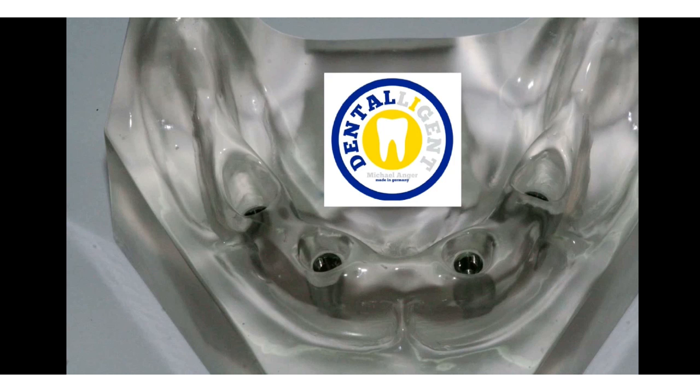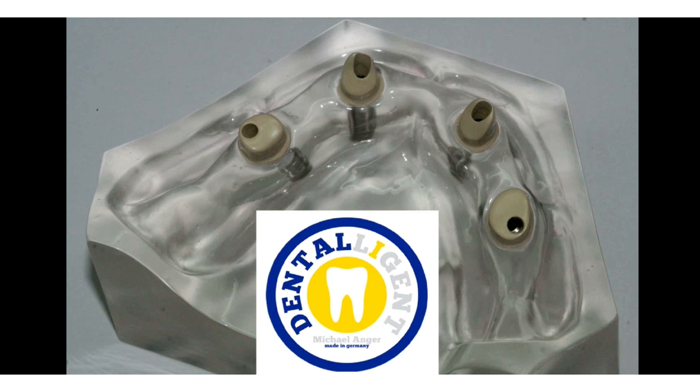We have redacted the manufacturer's logo that we incorporated in the model, as this material is not on the market yet. You can also see that checking the fit to the model was not a problem and the design of the gingiva profile was very easy to implement.